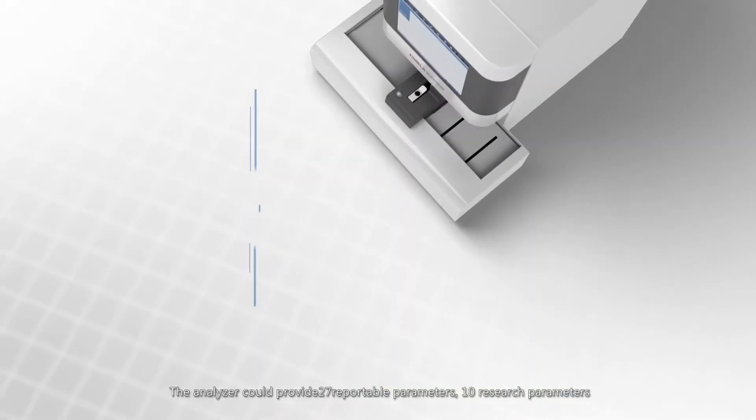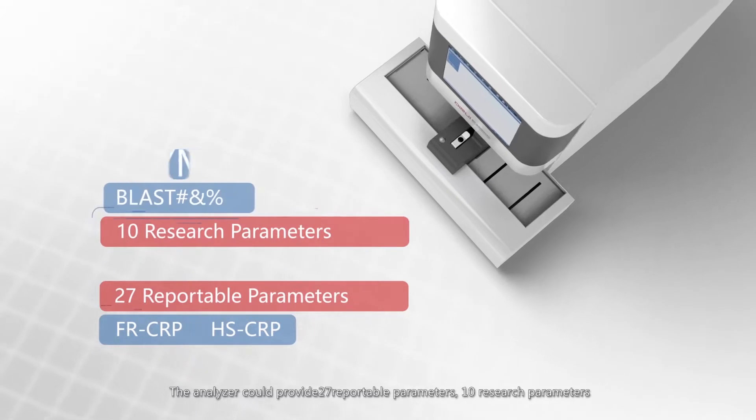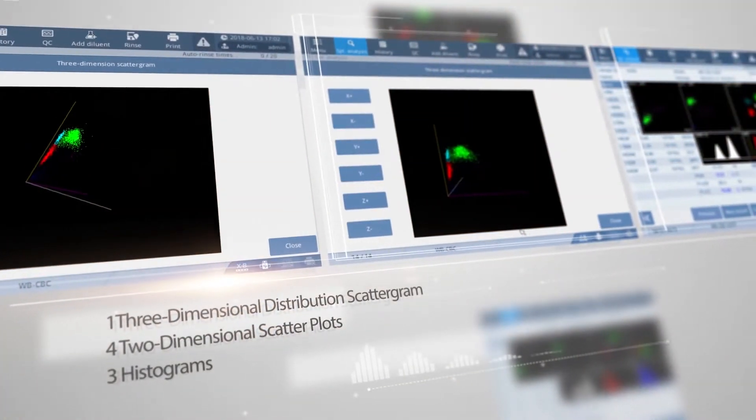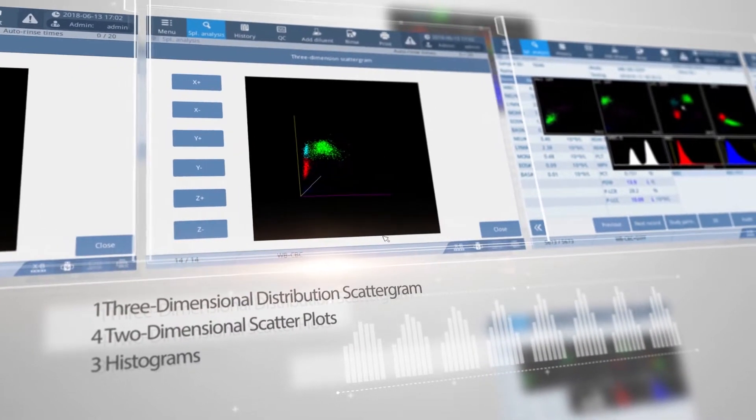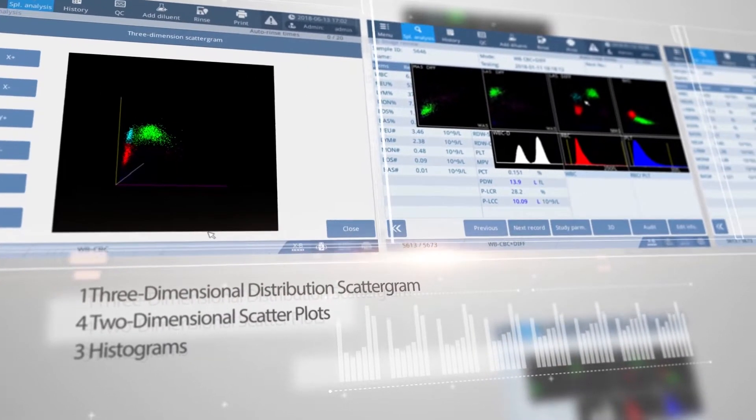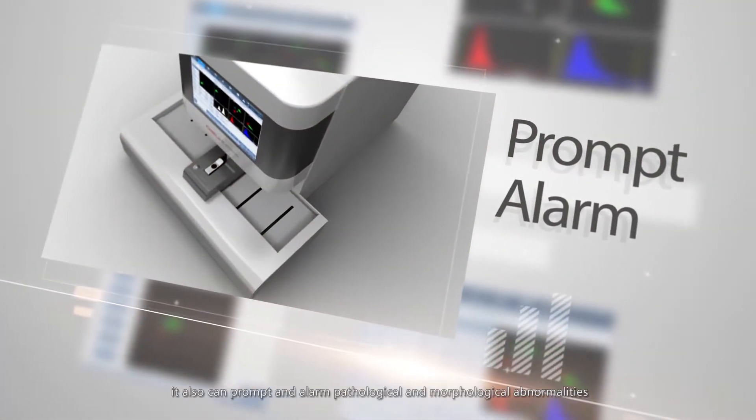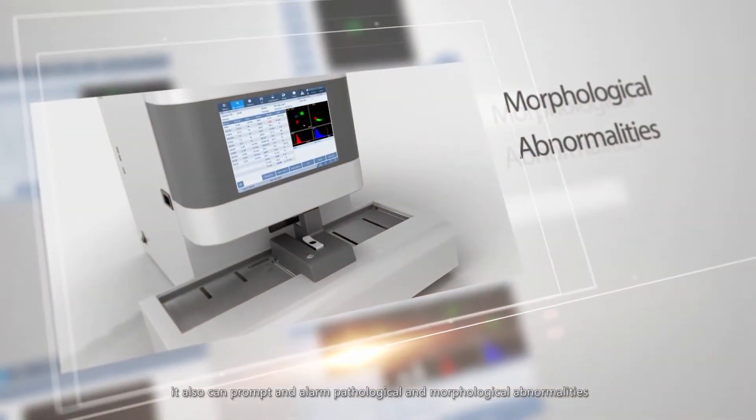The analyzer could provide 27 reportable parameters, 10 research parameters, 1 three-dimensional distribution scattergram, 4 two-dimensional scatter plots, and 3 histograms. It can also prompt an alarm, pathological, and morphological abnormalities.